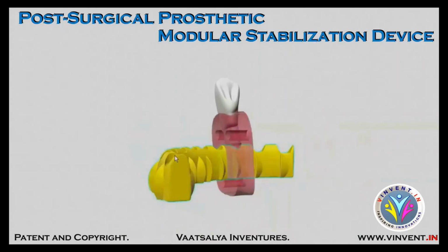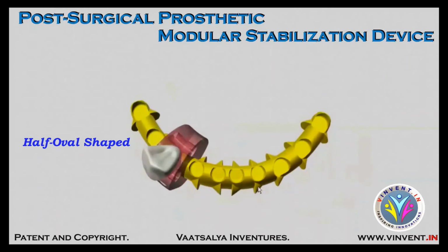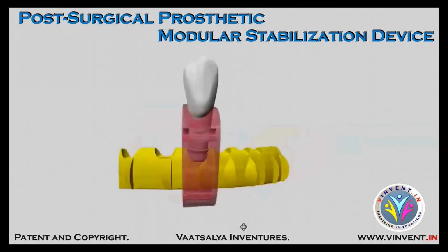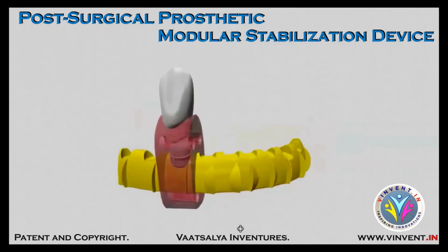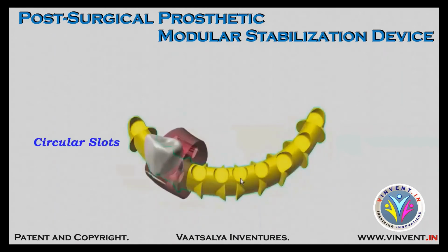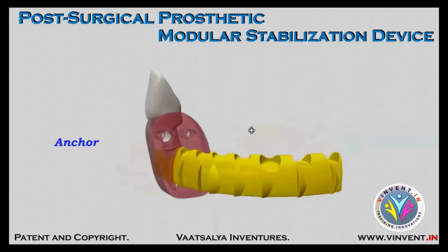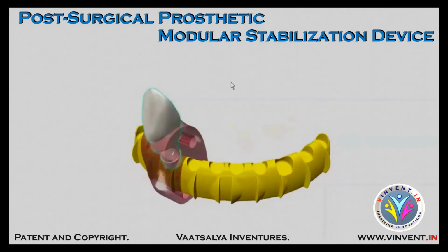So, the internal spine features a flat-bottomed, oval-shaped, flexible rim with fins designed to hold soft tissue components securely in unidirectional and anti-rotational manner. The distal end of internal spine can be sectioned and removed to shorten its length based on the number of missing teeth. Circular slots present on the top surface of internal spine act as rest space for tooth component to anchor and provide a firm rest upon occlusal loading.